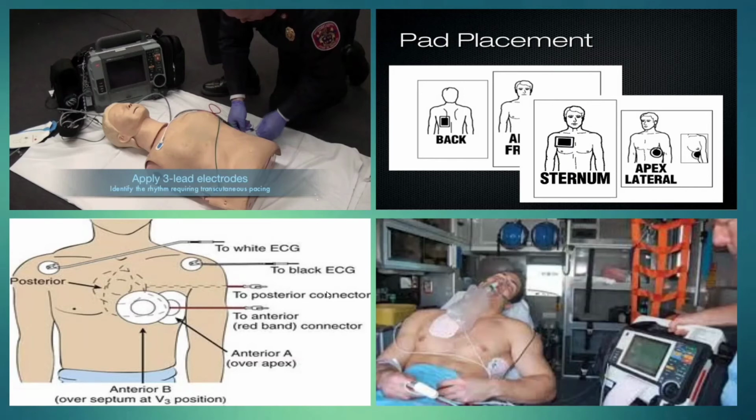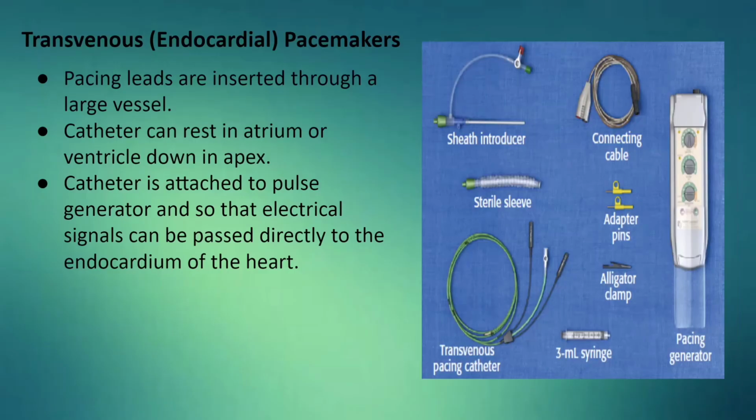Because we are delivering the electrical energy to the heart via the patient's skin, this is going to require much more energy than the other methods. So this should only be used as a short-term temporary measure.